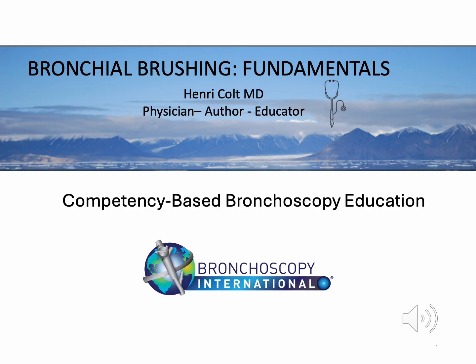In this lecture, we will review the fundamentals of bronchial brushing, including indications, equipment, technique, diagnostic yield, complications, and the principles that influence both procedural success and patient safety.